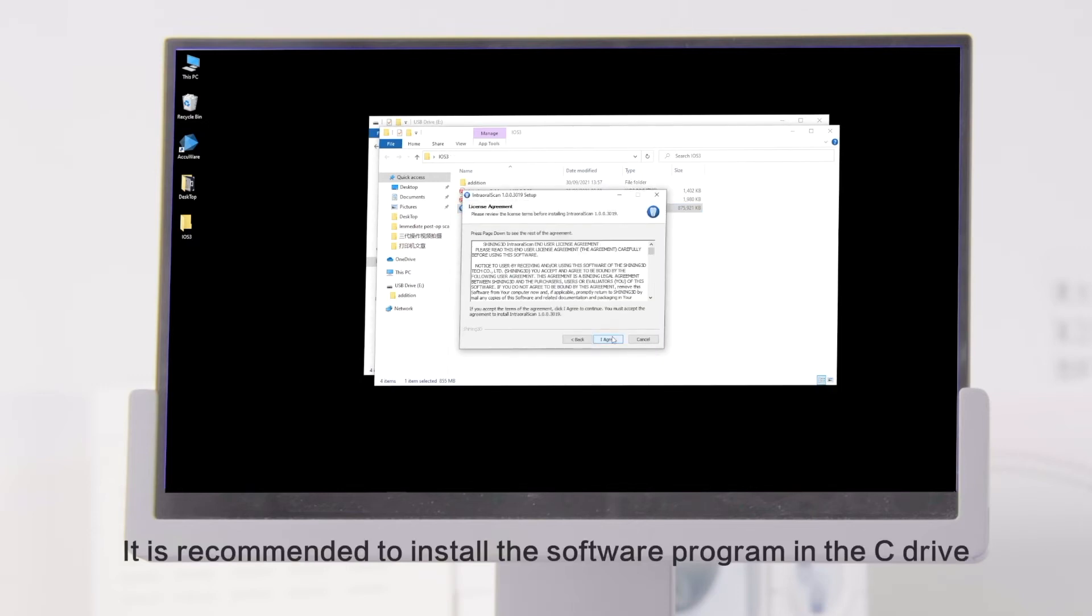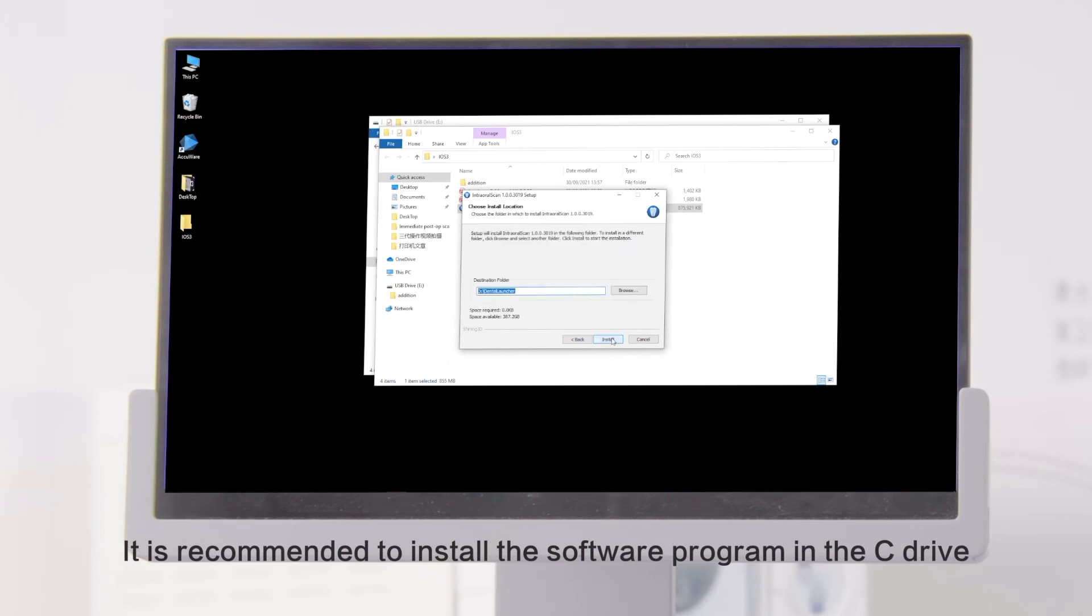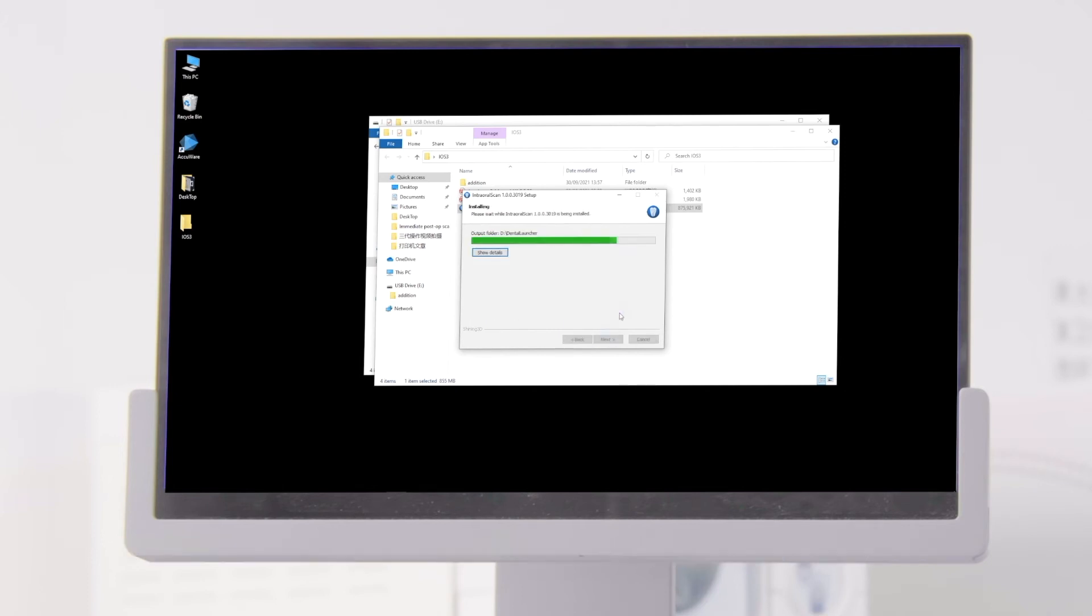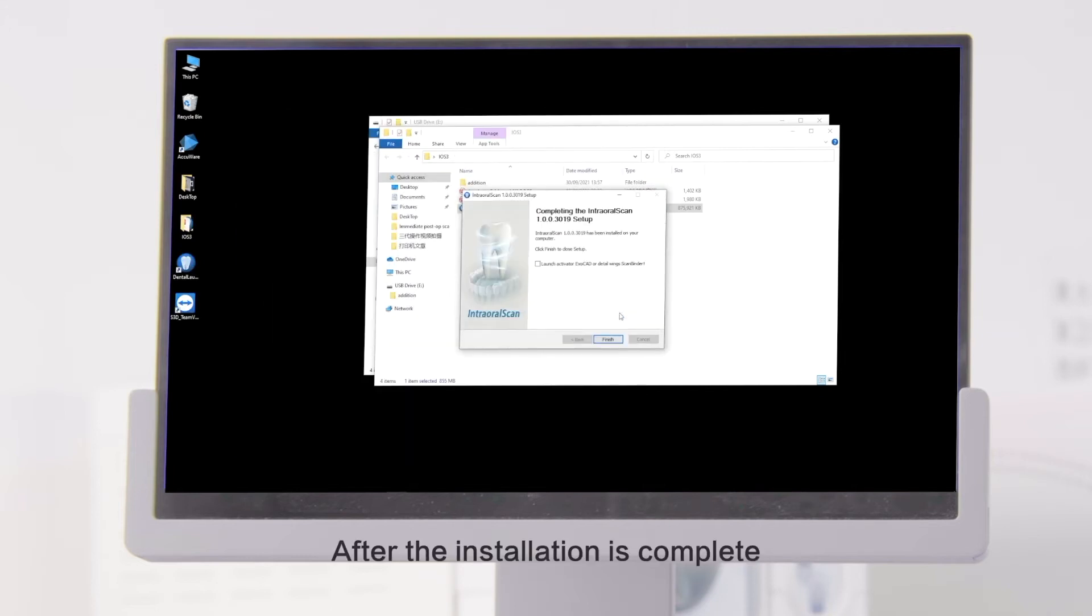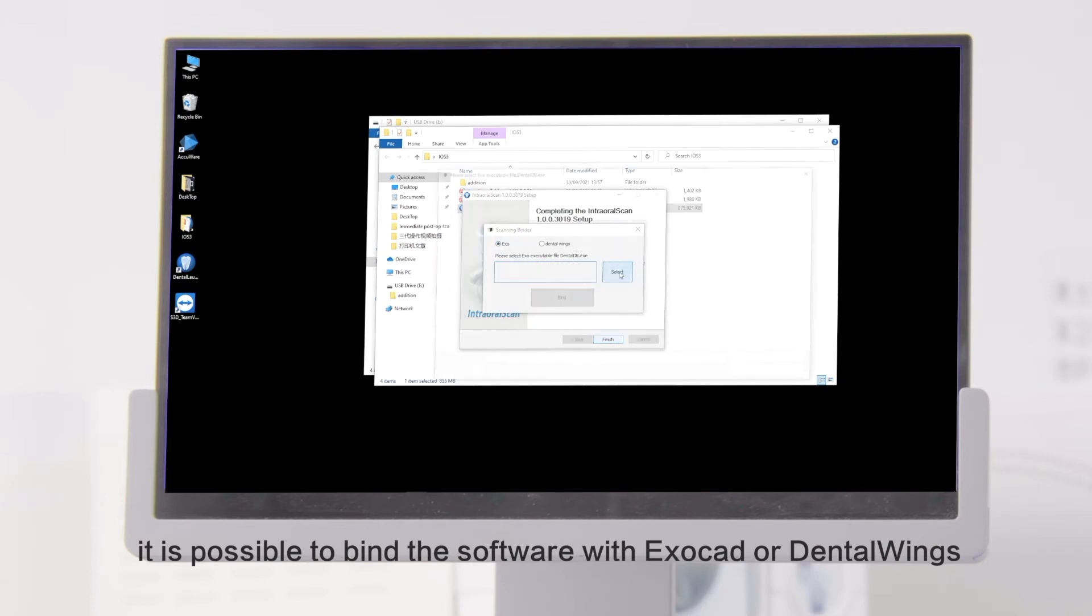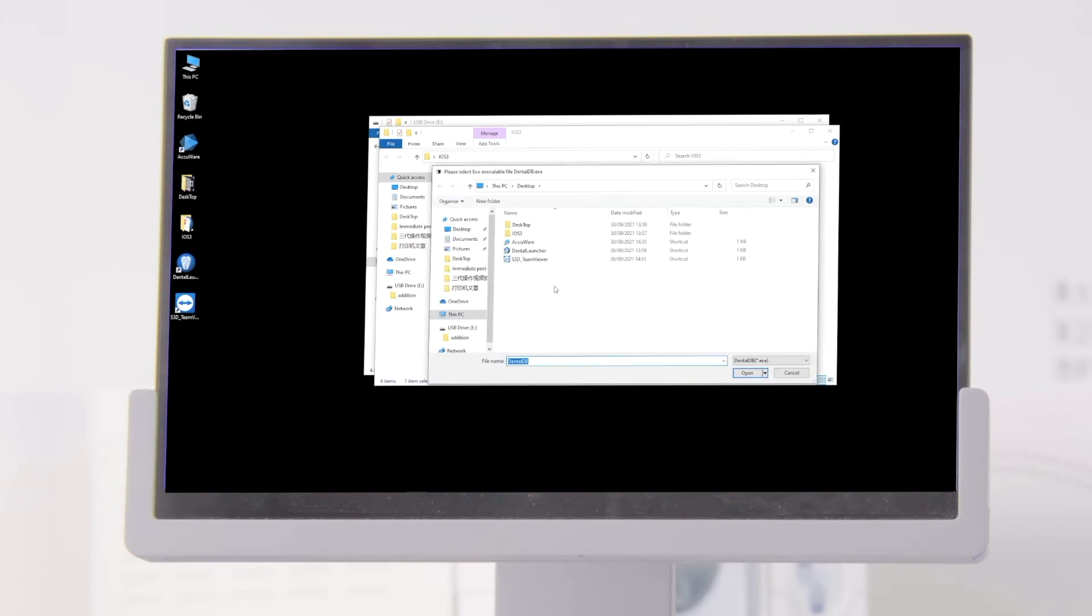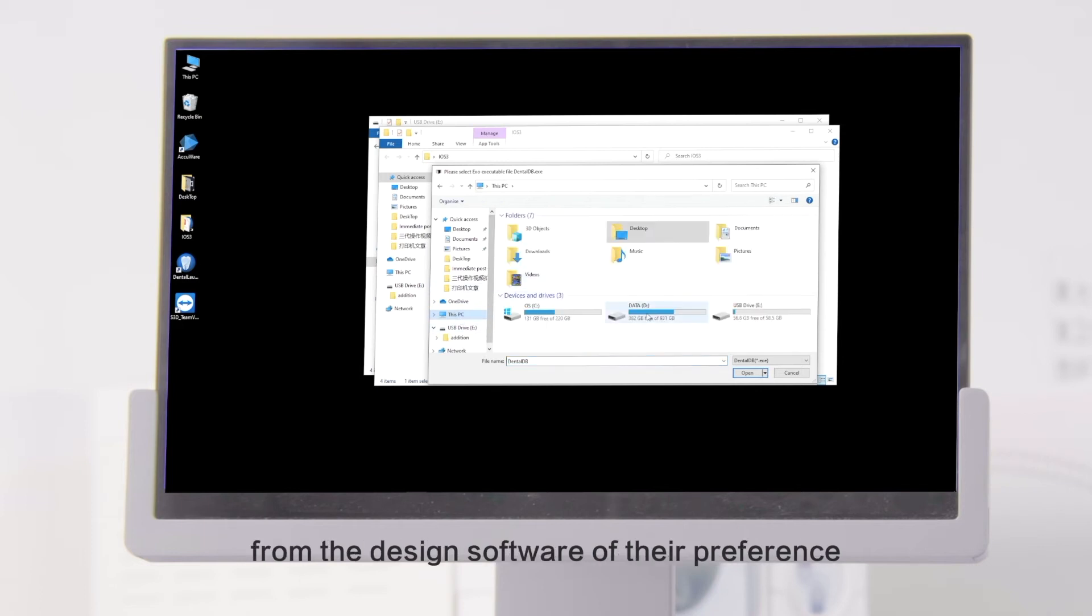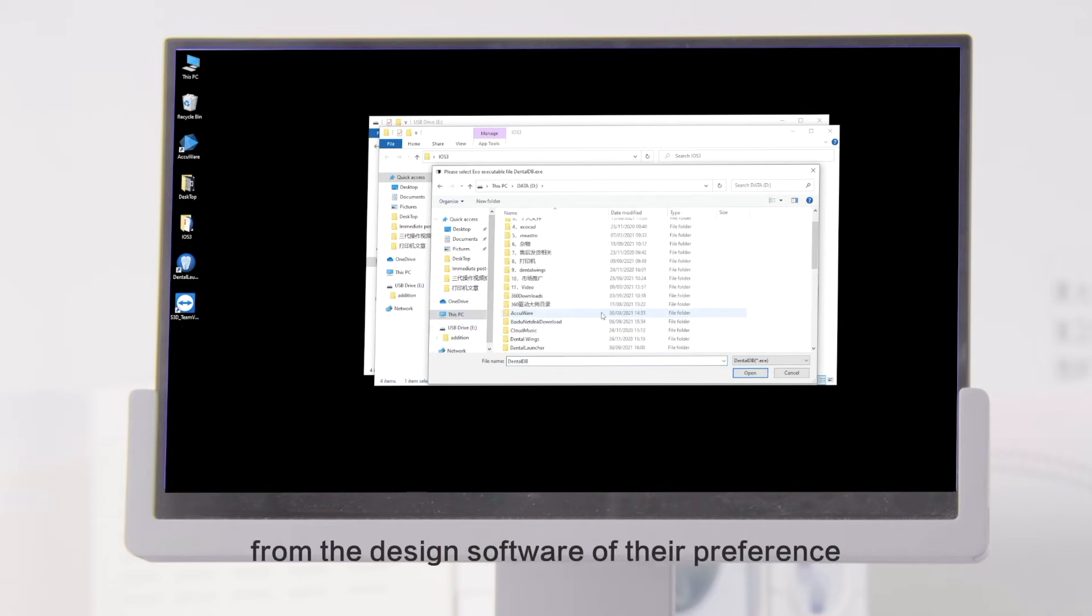It is recommended to install the software program in the C drive. After the installation is complete, it is possible to bind the software with ExoCAD or Dental Wings. This allows the user to create scan orders from the design software of their preference.